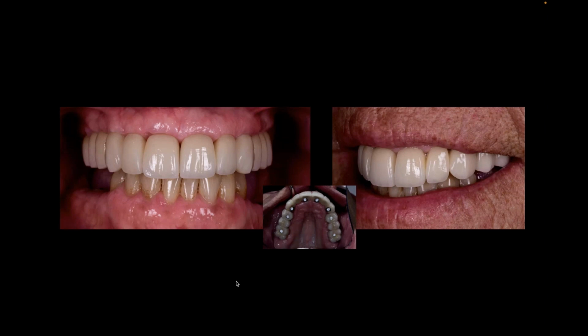If you do it all on and it's zirconia, if something goes wrong and something breaks, you're remaking the entire case. In my case, the patient bought 2 more implants, but we have access to a 3-unit bridge for the rest of her life, which is kind of nice. So if anything ever goes wrong, we take a 3-unit bridge out, it comes back, we can repair it, redo the porcelain. And by the way, I'm not doing a whole new arch.